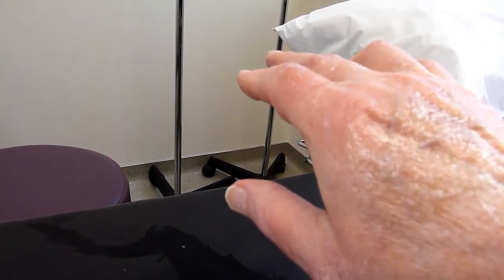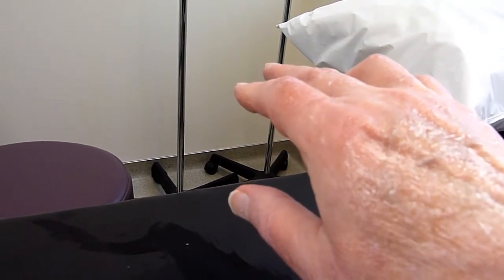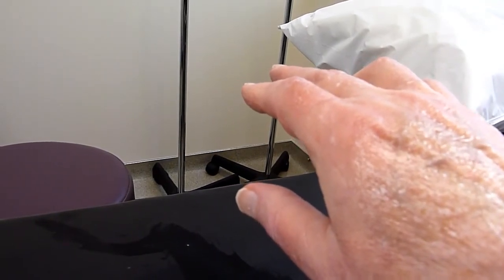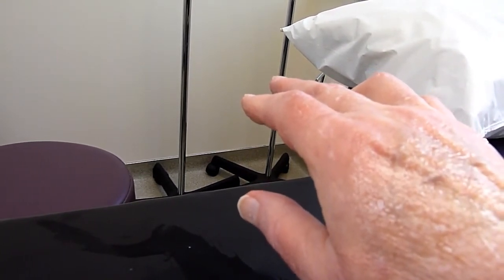Okay. All right. And the third and most important is, as you know, I'm going to be working near those nerves, and if I get to a spot where the nerve crosses over, it's an electric shock. It's not like maybe I feel a little something. It's an impressive zing that you will feel. And I make a mental note of that spot, and I work above and below that spot.